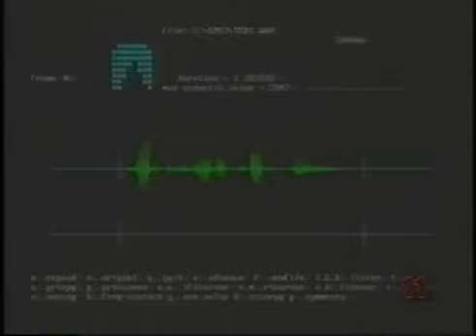I'm placing the cursor here at the end of the word TED. Where you would expect a D with alveolar contact. Note, however, that the D is completely assimilated into the place of articulation of the following velar closure.